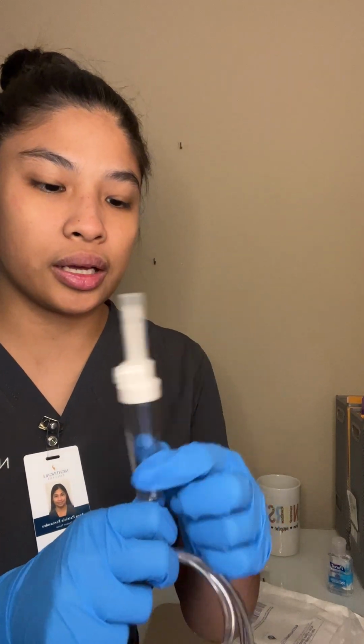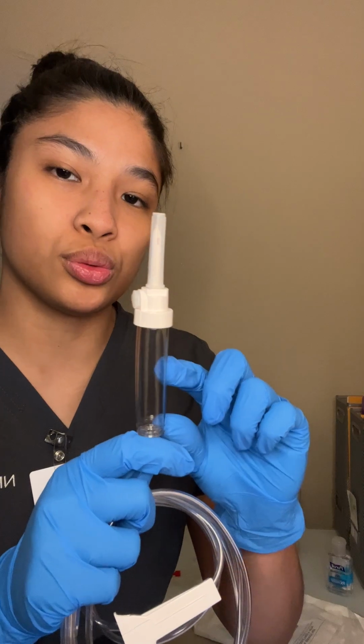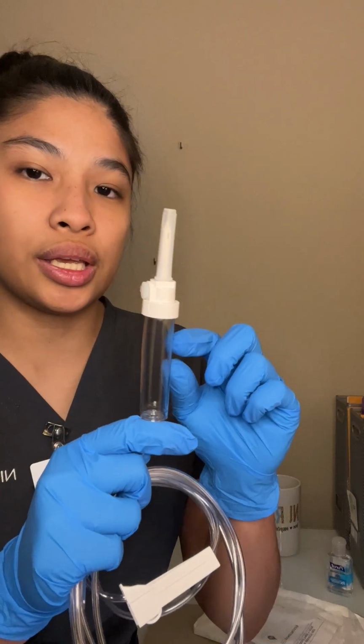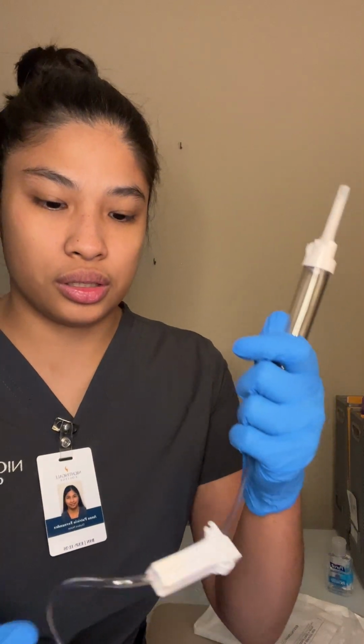The spike I'd want to keep sterile until I actually connect it to the bag. This is the drip chamber, so you want to fill it 1/3 to 1/2 full, making sure you're able to see the drops to be able to calculate the rate of the infusion.